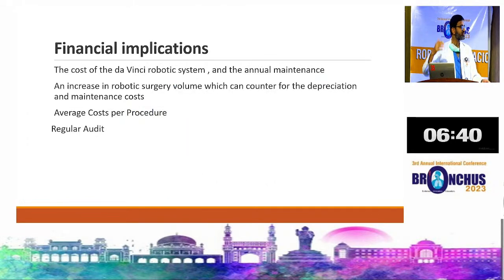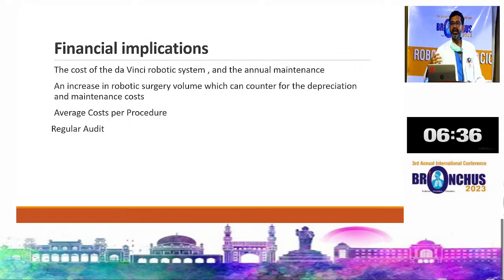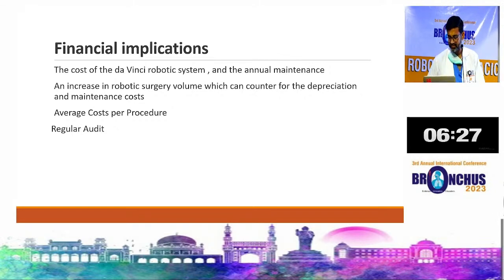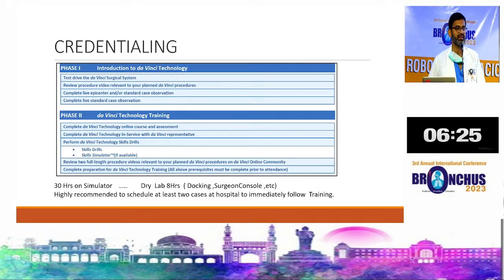Everybody's numbers reflect your overall growth because the costs come down. As more surgeons use the robot, your costs come down, the patient is benefited, you are benefited. Otherwise, there is no incentive for you to take the program forward if you are sharing the load alone. Financial implications, I don't want to go into it because it's crazy metrics once again. And what's most important is, who is a robotic surgeon?